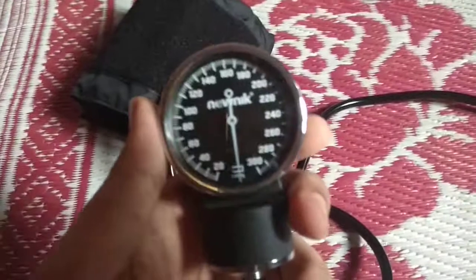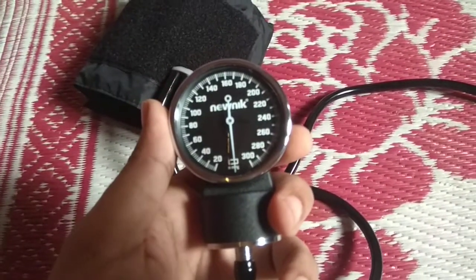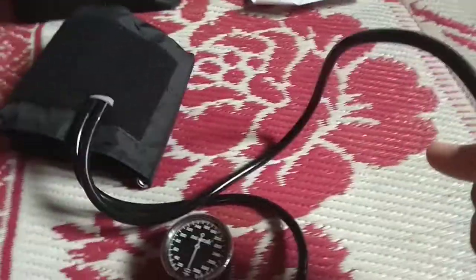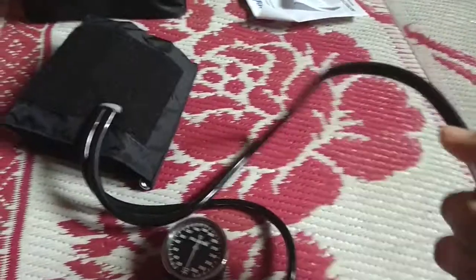Here you go — this is the meter, and you can see the readings up to 300 mm of mercury. So basically, this is the cuff in which you have to put the air by pressing this, and it inflates.